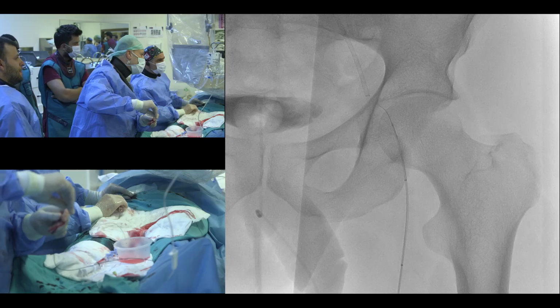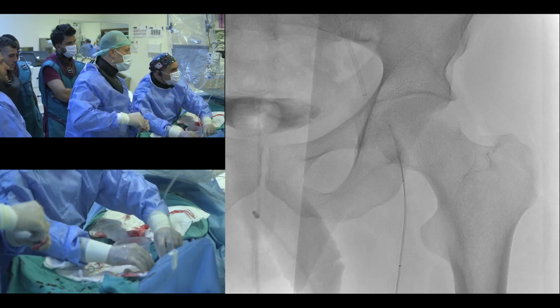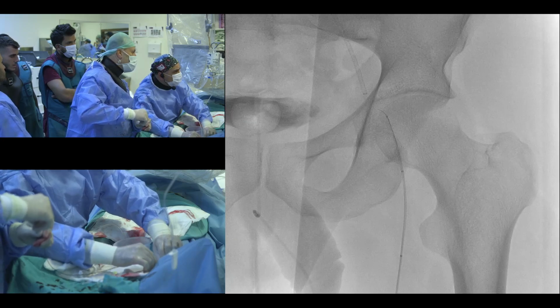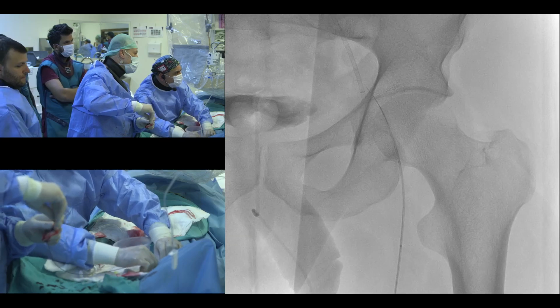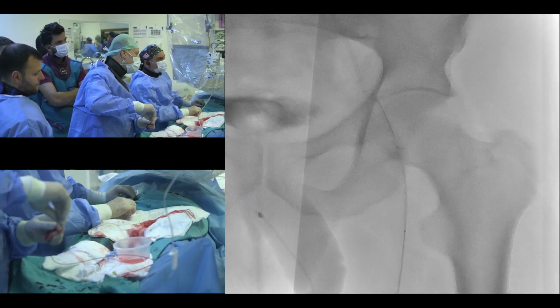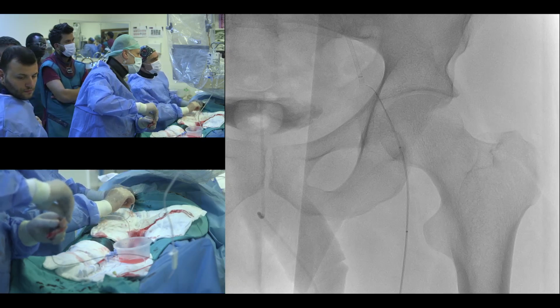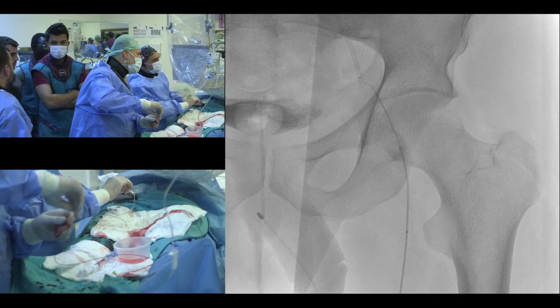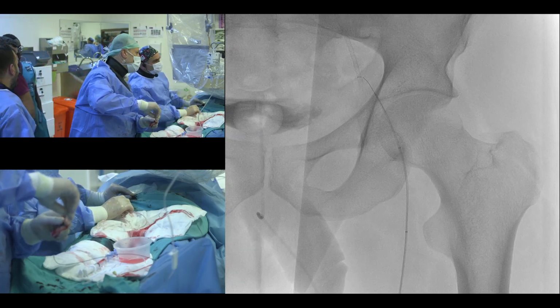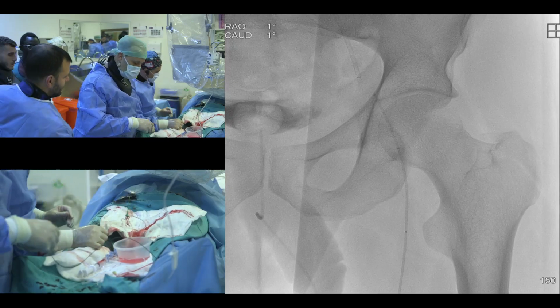Biraz daha açayım, arttırma. Biraz uzun açısını artırıp bir mikroyu biraz daha dayayalım. Maybe you can rotate antegrade. Yes. Biraz daha koaksiyel hale getirelim. Yes. Öyle. Ucuna açı var. Daha şunun arkası değmesin. Hemen düşmesin.